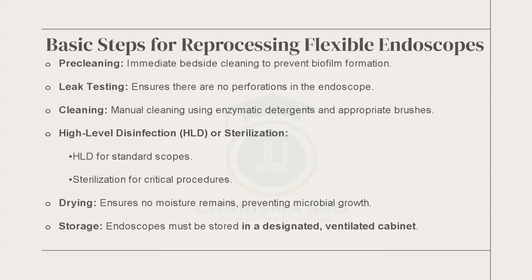All right. So leak test it. If it fails, still go ahead and clean it. If it doesn't fail, go ahead and clean it and let it continue to the next stage of what? The cleaning process. All right. So leak testing, then manual cleaning. We're using enzymatic detergent, using brushes, flushing every channel.